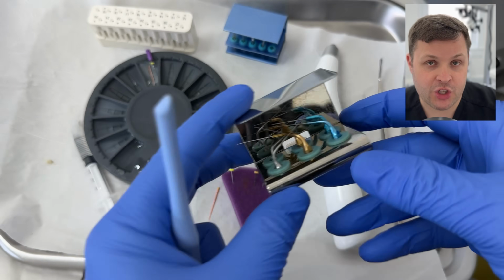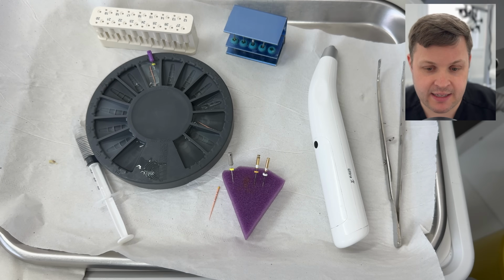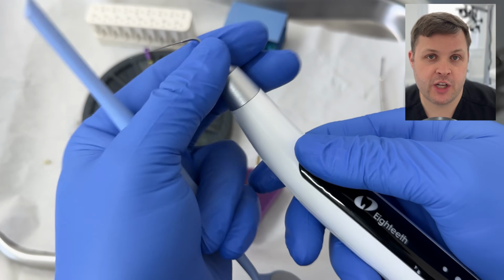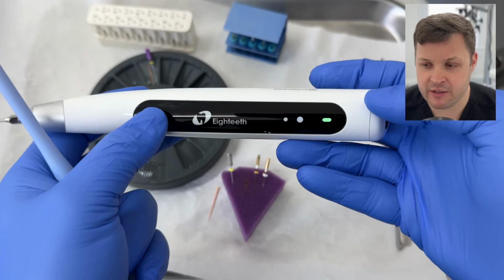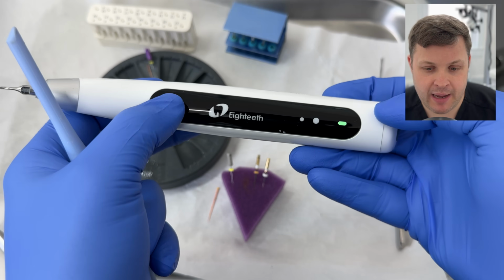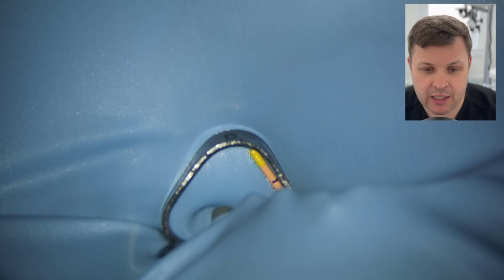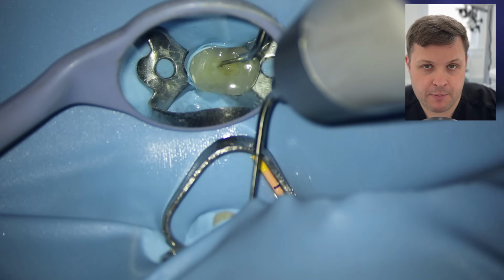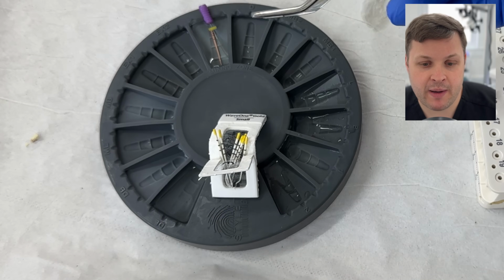And then we're going to use our final disinfection protocol. I'm using this Ultra X ultrasonic activator. So what this does is it ultrasonically activates the irrigant we're using, and you'll notice that this works really well because you're irrigating with your sodium hypochlorite. I'm going to use it on full power, by the way, and you'll notice that we get this kind of pond water. It starts to go a bit of a grey colour, and you know that you're removing all that debris off the canal walls. And we're using sodium hypochlorite activated, EDTA activated, and a final rinse with sodium hypochlorite.